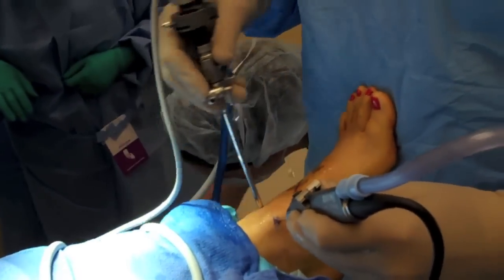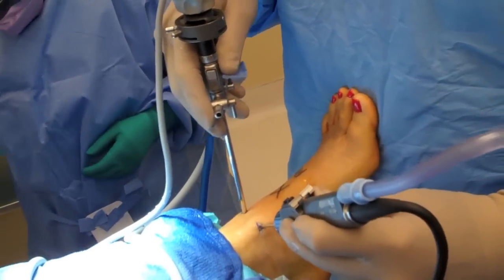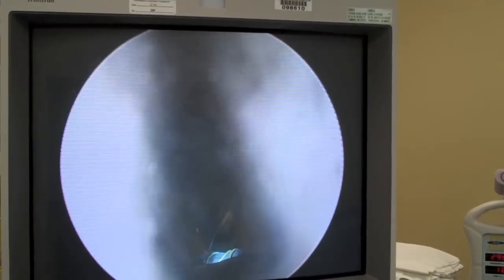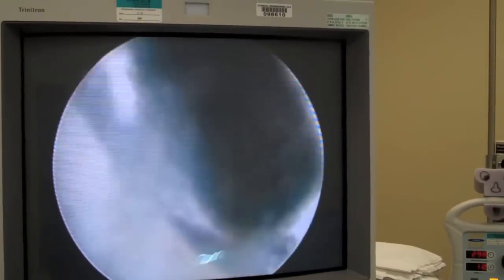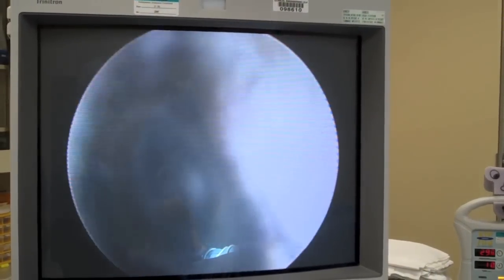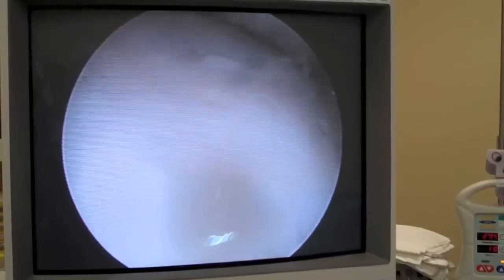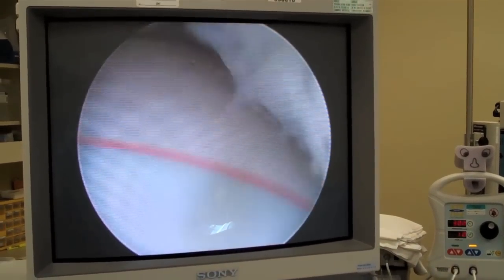Triangulation is utilized to find the shaver. The shaver is brought to the scope under direct visualization while watching the camera setup. It is very important to shave only when you can visualize the shaver. Do not shave the soft tissue if you cannot see the shaver. We want to try to shave away from the articular surfaces. You can either use a pawing or dabbing type motion or a sweeping type motion — those are common terminologies used for types of debridements with a shaver.